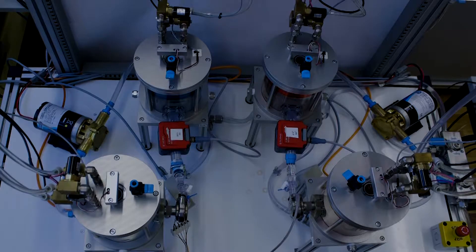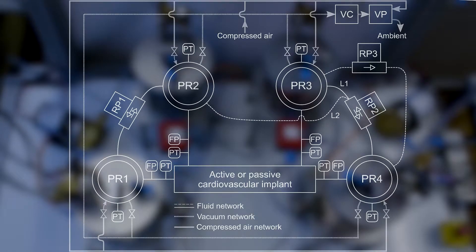The hardware part of the hybrid mock circulation is divided into a hydraulic and a pneumatic system. The hydraulic system comprises four pressure reservoirs. Their pressures are controlled by using pressurized air and vacuum.